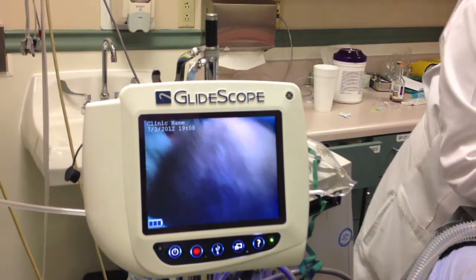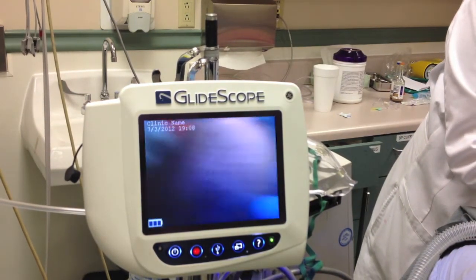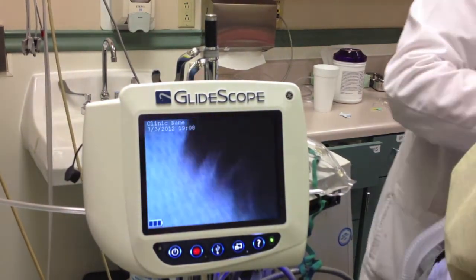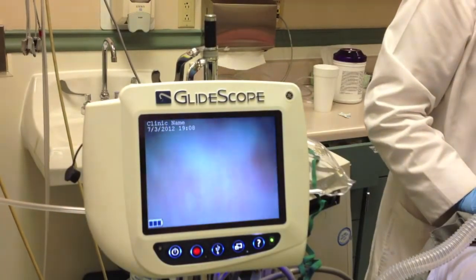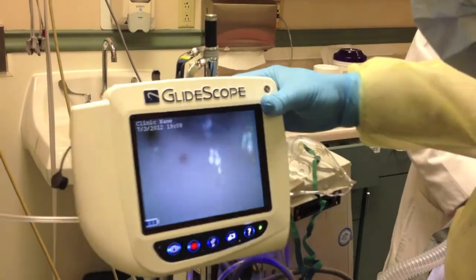The patient's saturations were 94–95%, but as we bag-valve ventilate, we bring it up to 100. The more you keep it at 100 before starting the procedure, the more time you'll have to do what you need to do. Make sure you always have suction available and ready to go, and that you have all the emergency airway equipment in case of any complication.